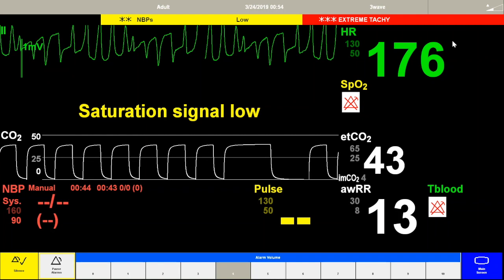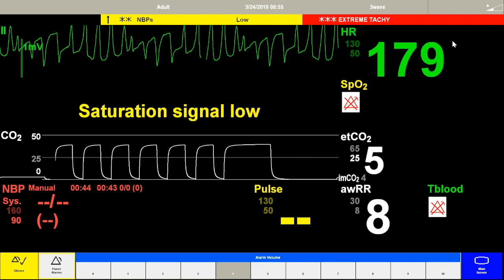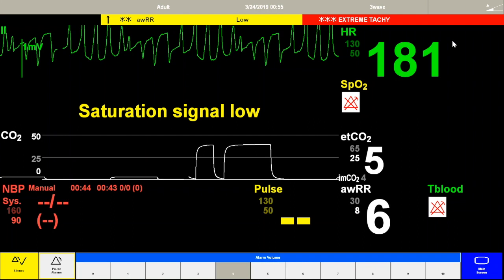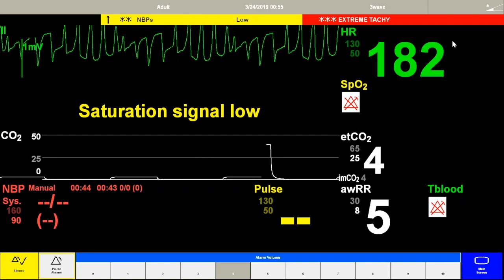Hopefully at this time, we have the patient on high-flow oxygen by non-rebreather mask, because this is a lethal cardiac arrhythmia and should be treated. We're going to probably find out that the blood pressure is pretty low. Although they have a respiratory rate, the person can then deteriorate. What our signs are showing right now is that the respiratory rate is diving down, end-tidal CO2 is diving down as well, and we see the square waveform disappearing. We can now assume that our pulse has disappeared as this chaotic rhythm deteriorated into cardiac arrest.